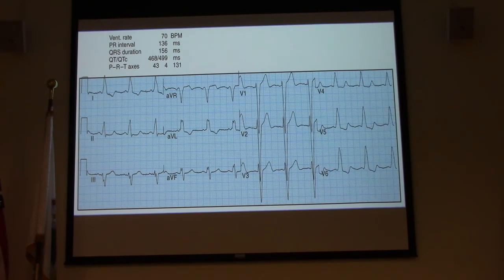And also the rabbit ears, some people will say, well, if the right one's higher, it's the right, if the left one's higher, it's the left. I'll be honest with you, I get very confused when they start talking like that. I just go as simple as can be. I look at my numbers, which way does V1 point, and that is the right way to make the determination.